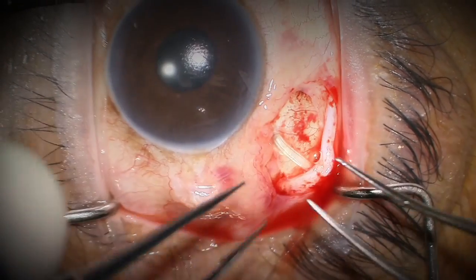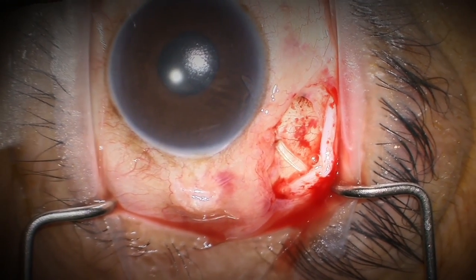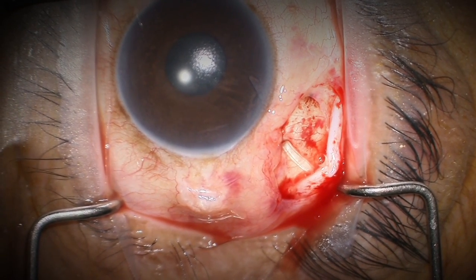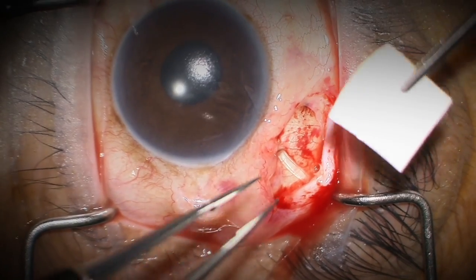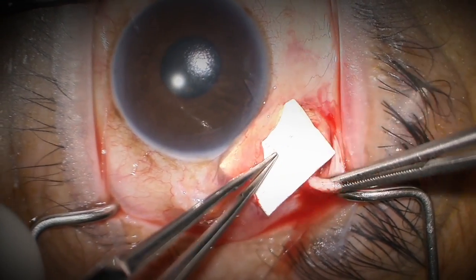There are no sutures at this point and I'm highly confident the tube will not move and the plate is going to stay behind the equator. If I had any movement of either during the surgery, I would simply suture them into place with either an 8-0 nylon or perhaps a 7-0 vicryl suture.